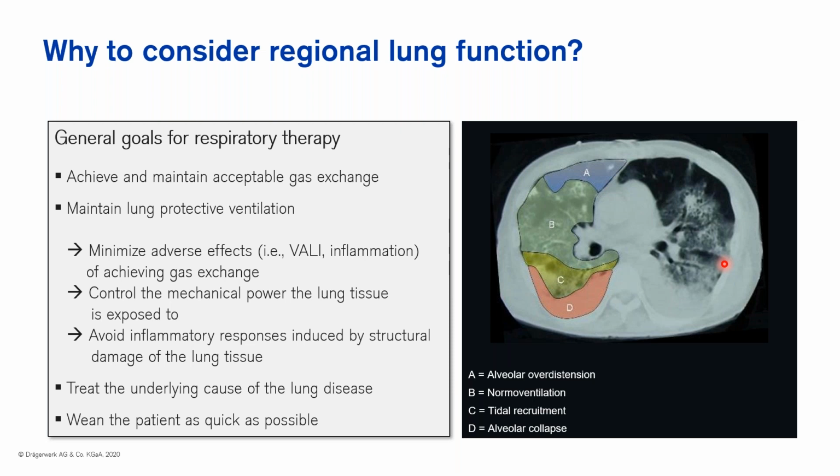So let's have a look at why to consider regional lung function. What are our general goals for respiratory support? What are we trying to achieve with mechanical ventilation?